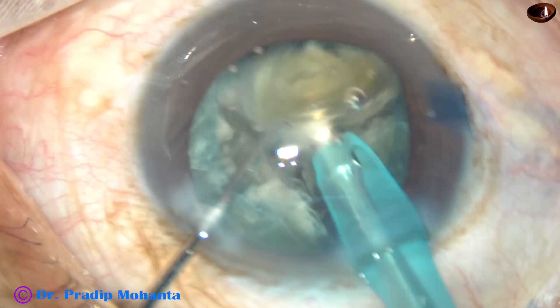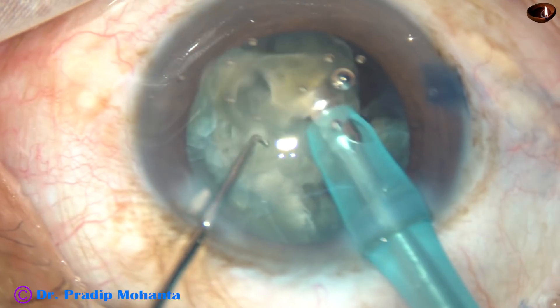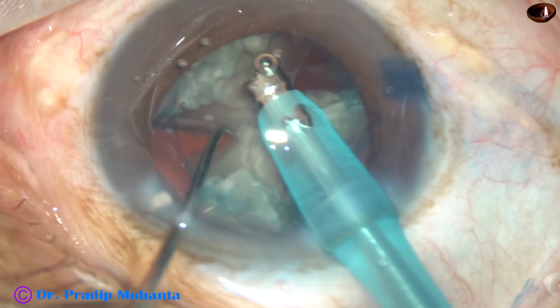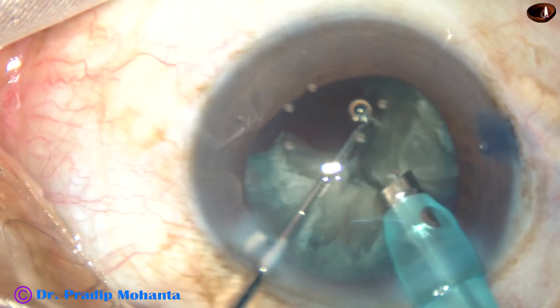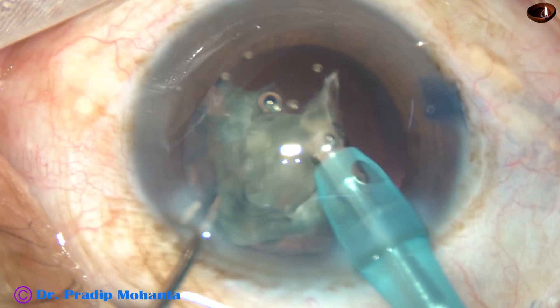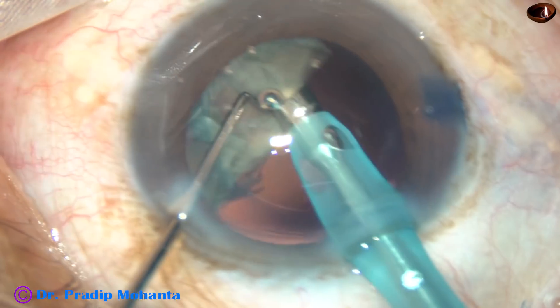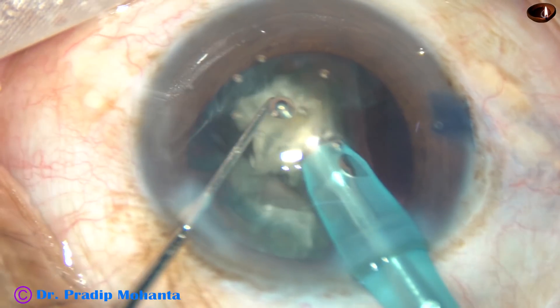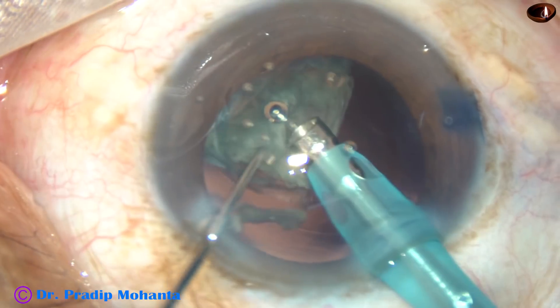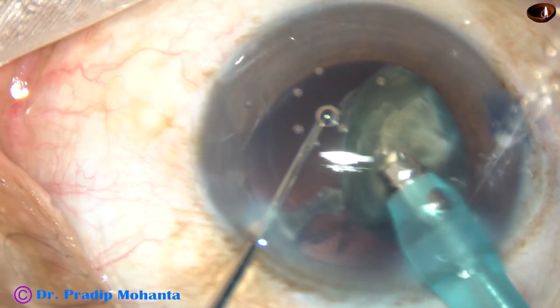Now we can elevate one piece like this and emulsify it. Now I hold the second piece, starting from the apex of each fragment and emulsifying it. We can see that in this case there is hardly any cortex — everything has been incorporated in the nuclear mass.